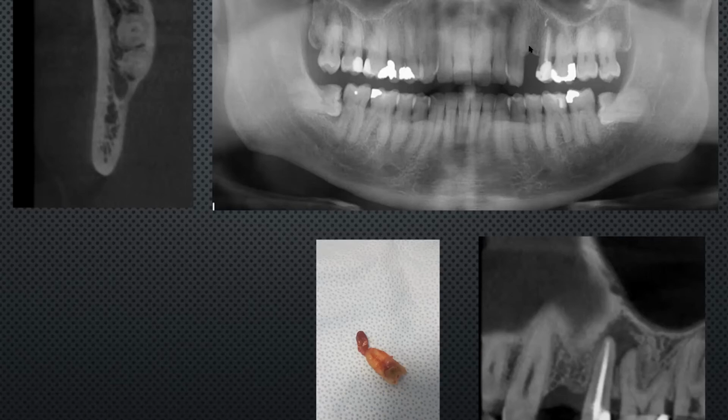Yeah. So on that incision on the ridge, are you going more palatally just for that access point, or is that just right down the middle of the ridge? Oh, it depends on where the keratinized tissue is. You want a nice healthy cuff of attached keratinized tissue around each implant. So usually just on the crest, sometimes a little bit more palatally, because you tend to have a little bit more tissue there, and you can borrow it. So bring it across so that when you close, you then have more keratinized tissue on the buccal aspect. And that's important for aesthetics as well.